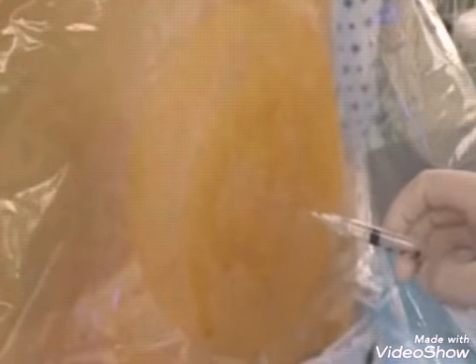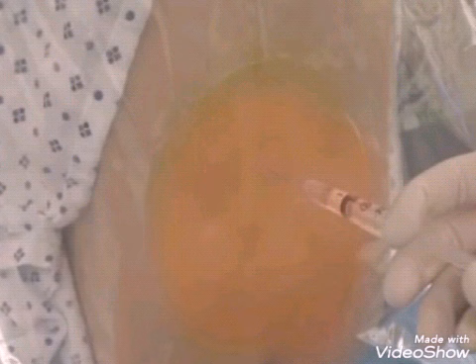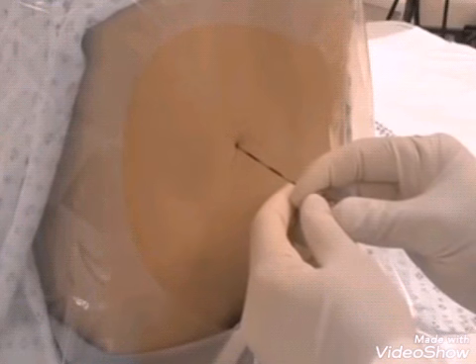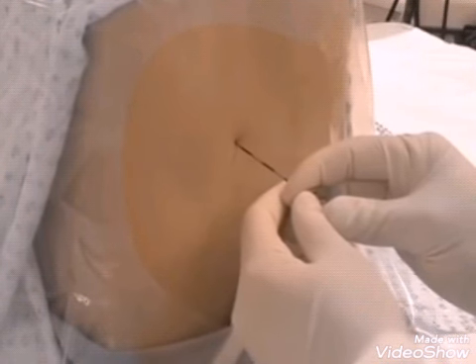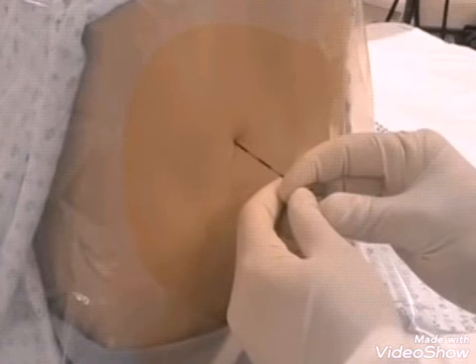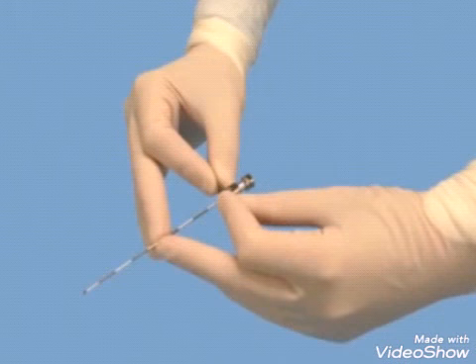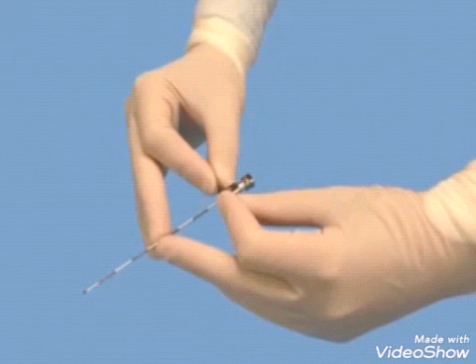Use the infiltration and finder needle to infiltrate the skin and superficial tissue with 1% or 2% lidocaine to help maximize patient comfort. You can also use this needle to identify the approximate depth of ligaments and bone. With the stylet in place, insert the epidural needle through the same entry point that you used with the finder needle. The purpose of the stylet is to prevent the tip of the epidural needle from becoming obstructed by the patient's tissue. One technique is to hold the epidural needle with the bevel facing up, using both hands, with thumbs and index fingers holding each side of the hub.